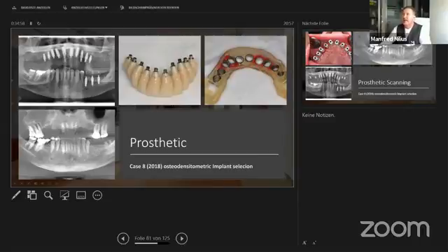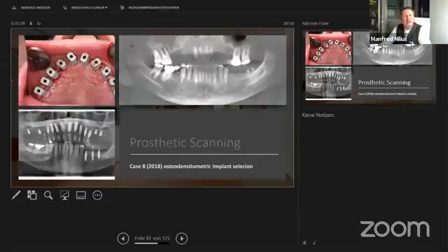We wanted to see how far we can go with digitalization, so we decided to have this bridge in one piece, like a horseshoe, but that gave some problems. Maybe this is not actually on the market yet, so maybe the scanner systems are not that great to have a full arch reconstruction at this moment. But it was 2018, and the scanner generations are even better now.